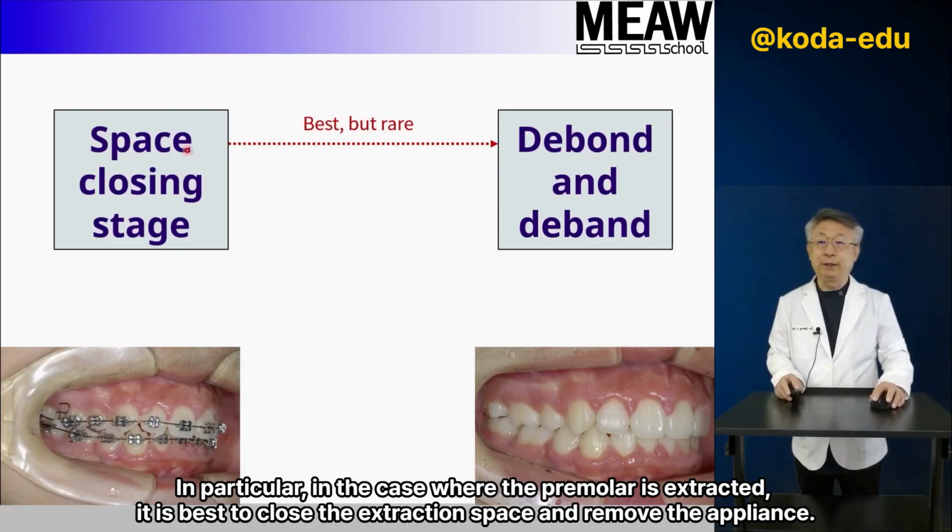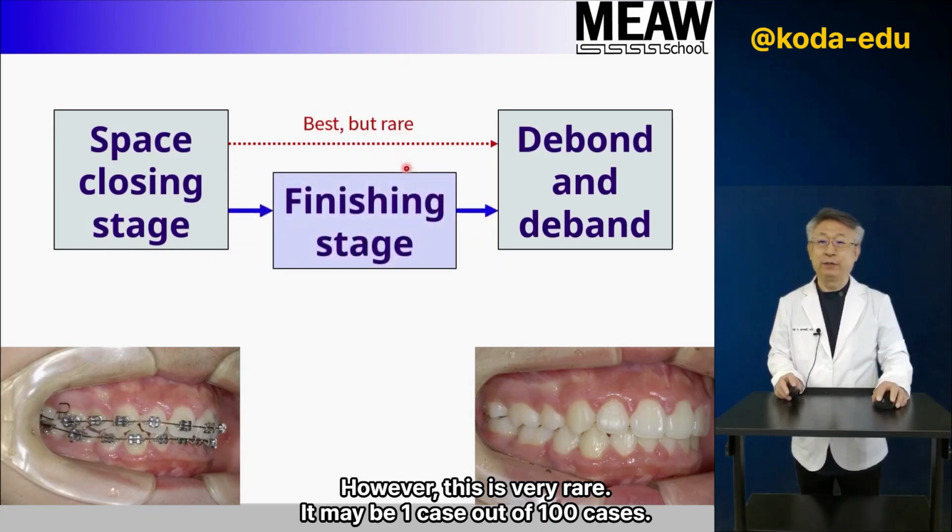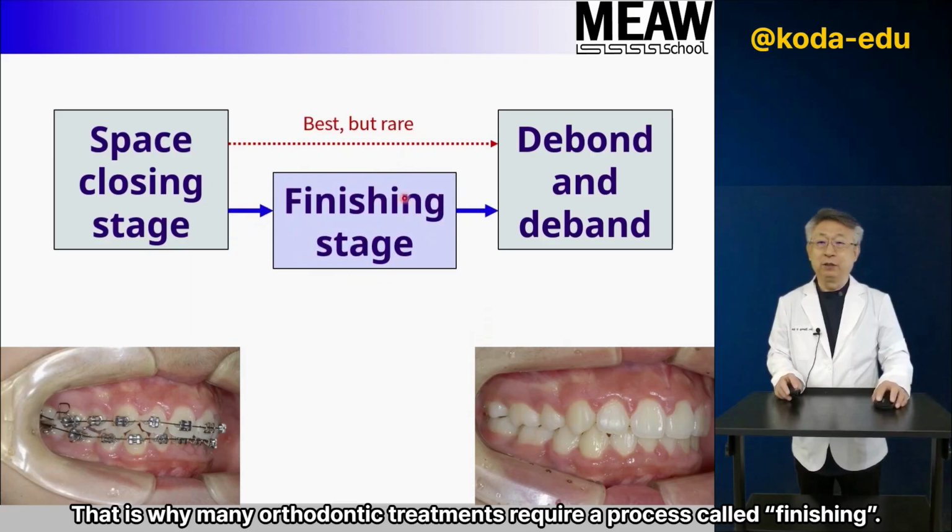In particular, in the case where the premolar is extracted, it is best to close the extraction space and remove the appliance. However, this is very rare. It may be one case out of 100 cases. That is why many orthodontic treatments require a process called finishing.